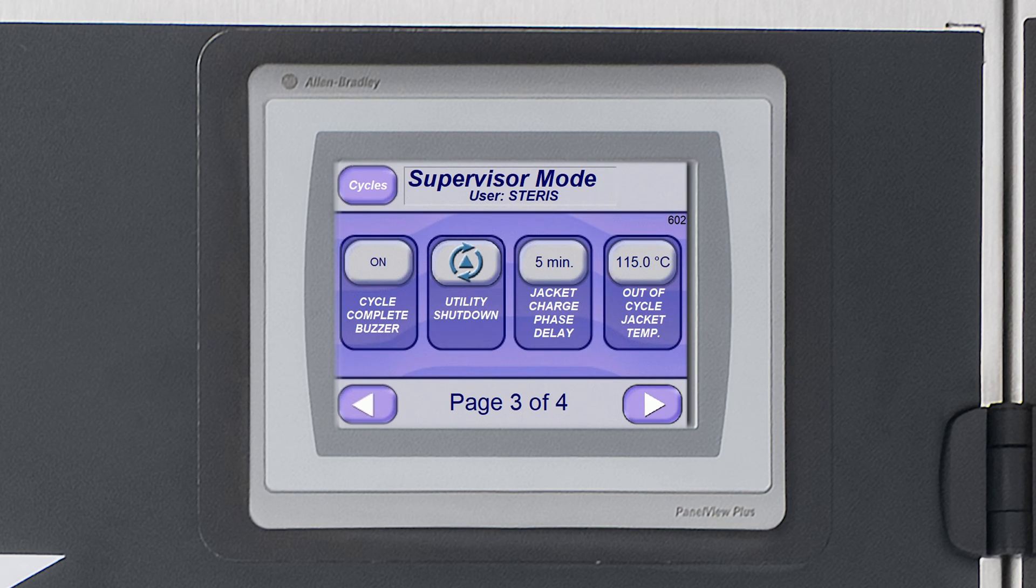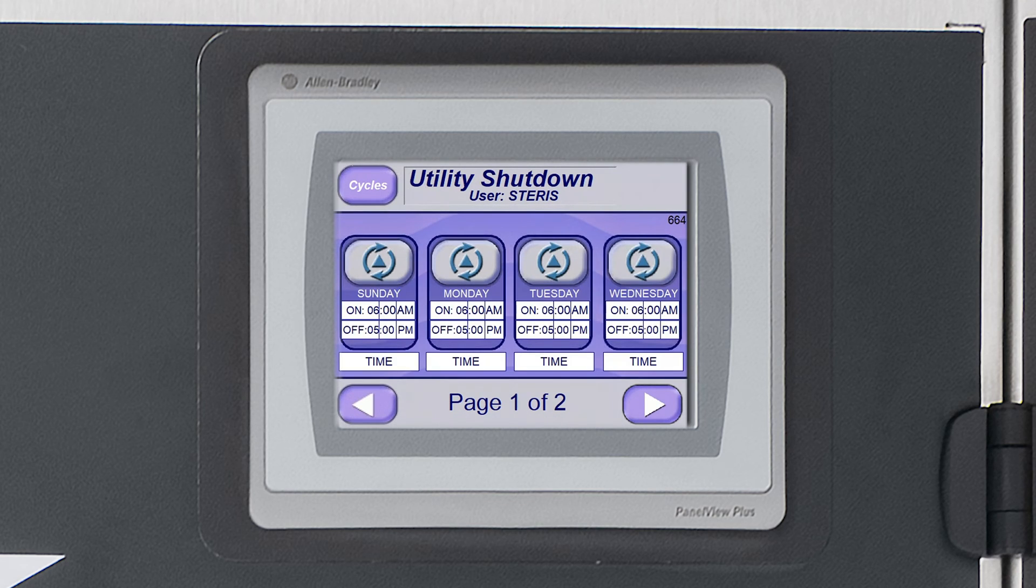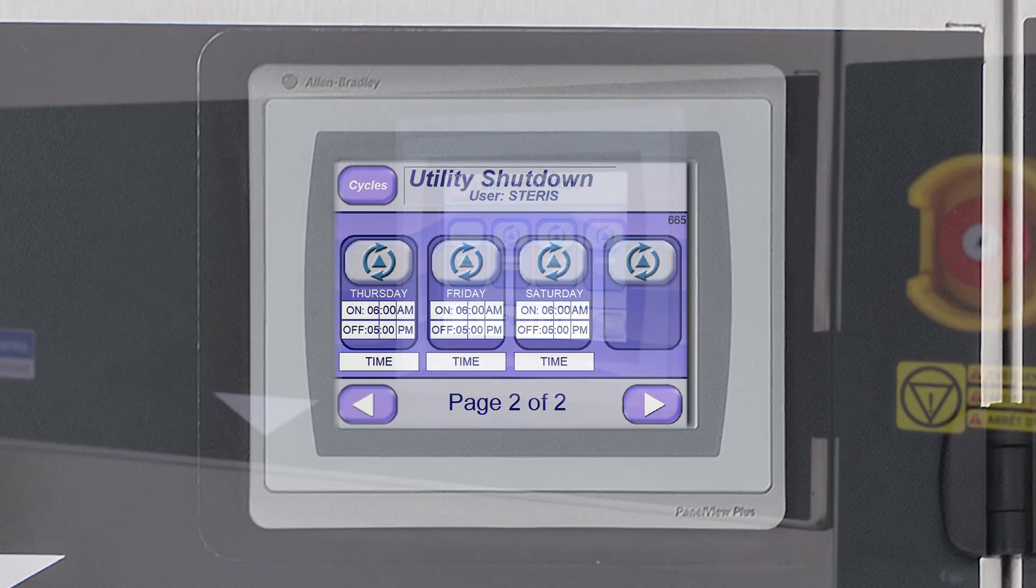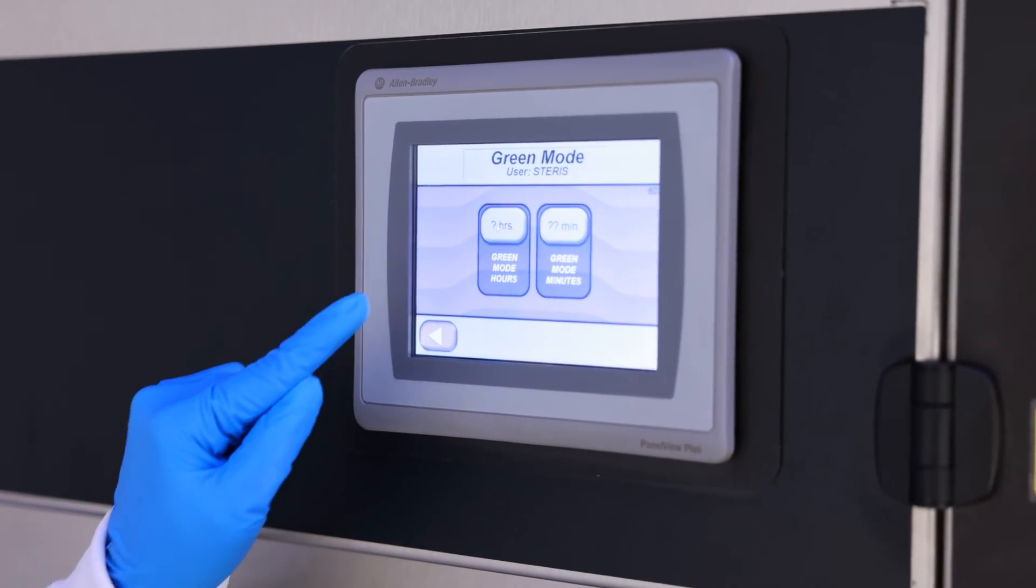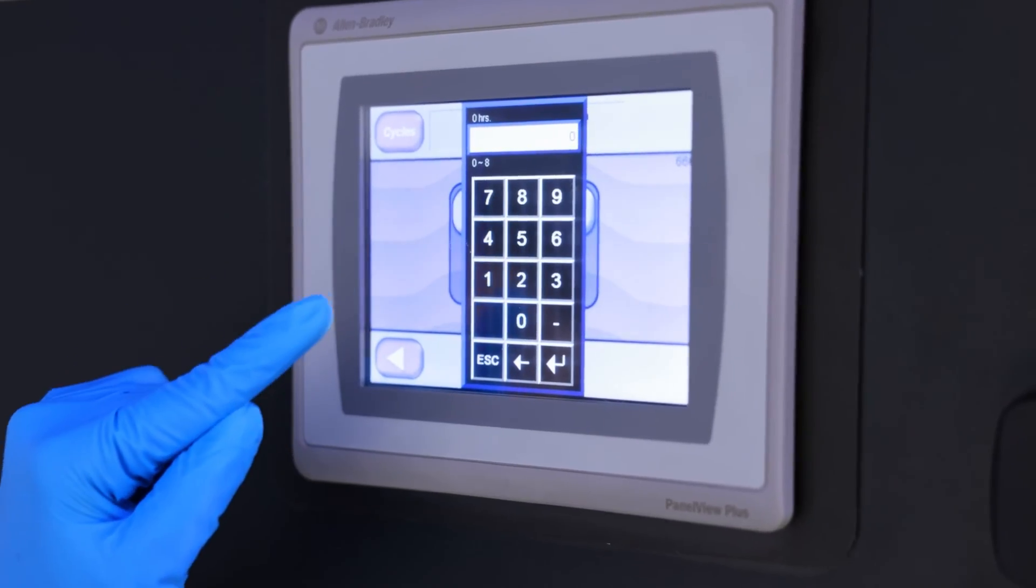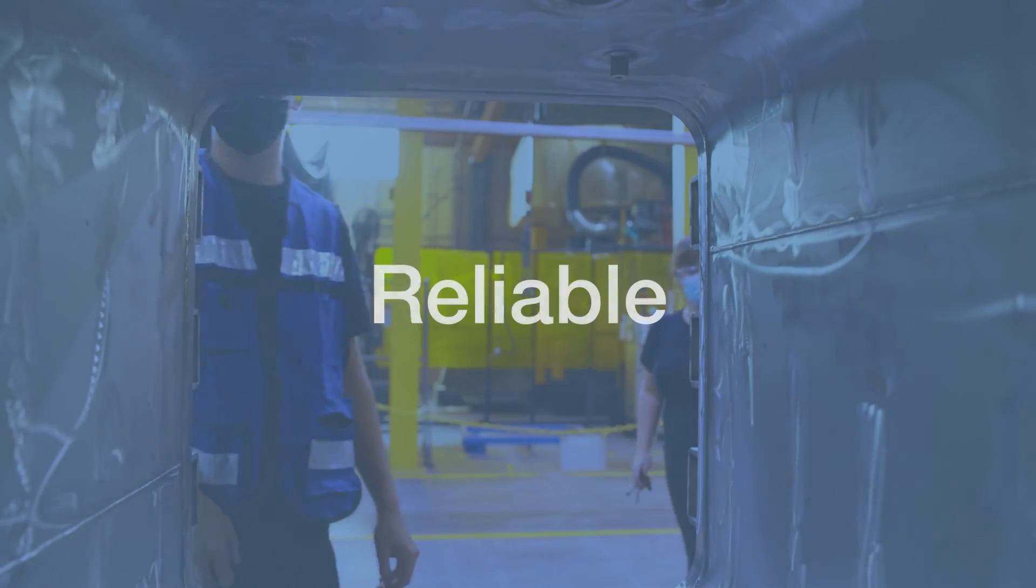The AMSCO 600LS can be programmed to automatically start up each morning and shut down each night. The sterilizer also has a green mode that allows you to program automatic jacket and generator shutdown during slow times of the day, saving additional energy and water.